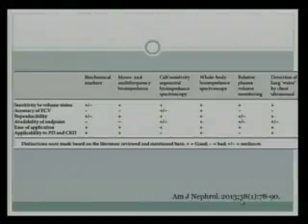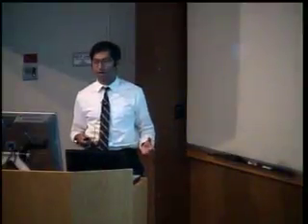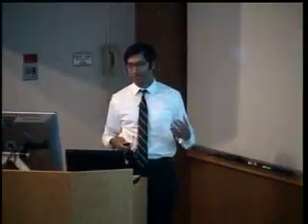Same for relative plasma volume monitoring. You have to already be performing dialysis to get information. You can't do it before. But the real advantage of BIS is that you can do the measurement beforehand, get some information about how much fluid to take off, and actually try that.